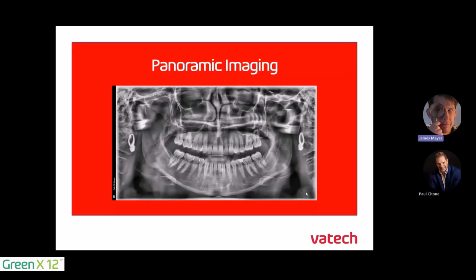So here's a really nice image. I would say this patient's been positioned properly, but Paul, what are you seeing in the image? Well, I would say the head's tilted slightly, but we see the earrings in the image. And then again, also the streaking above that looks like little rectangles from the earrings. So I think that's the thing: we get our earrings in here and the sinuses, we get that streaking effect and the distortion above those earrings.